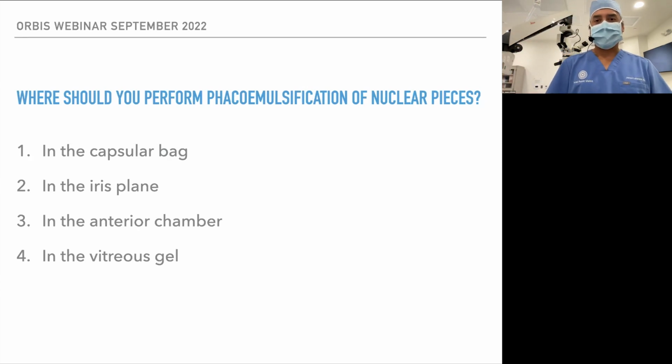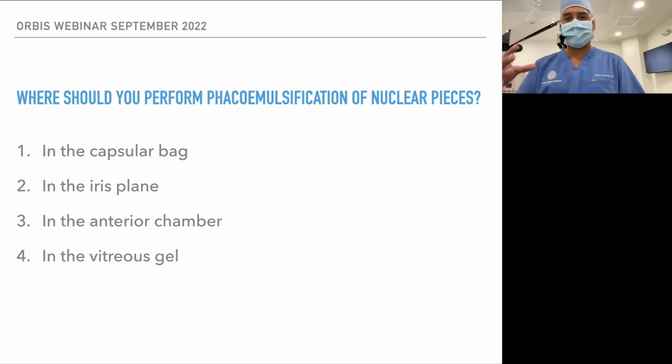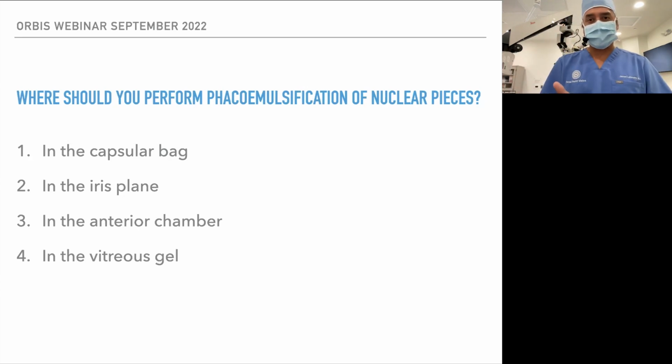So, of course, we're talking about divide and conquer in this technique. You guys go ahead and put your answers in, but this is a good thing because when you're watching my case, you'll see where I leave the phaco tip when I'm eating up those quadrants and what plane you want to be in. I want to tell you ahead of time because you can't tell that just from looking at the video. So in the capsular bag, or the iris plane is the correct answer.